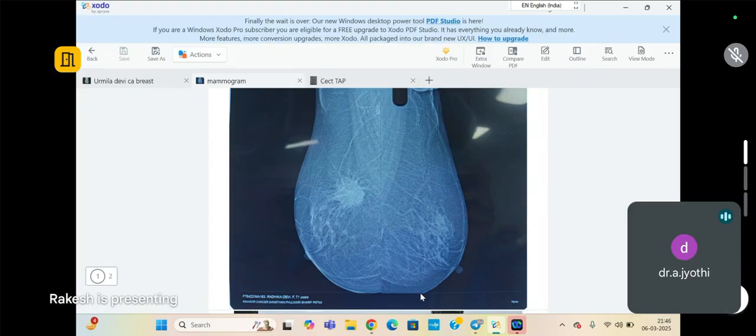So what does PET miss? Brain lesions. Liver lesions. Yes, it can also miss liver. Brain, liver. Bone marrow. PET is good for bone. Mainly brain lesions. Liver is better on MRI.